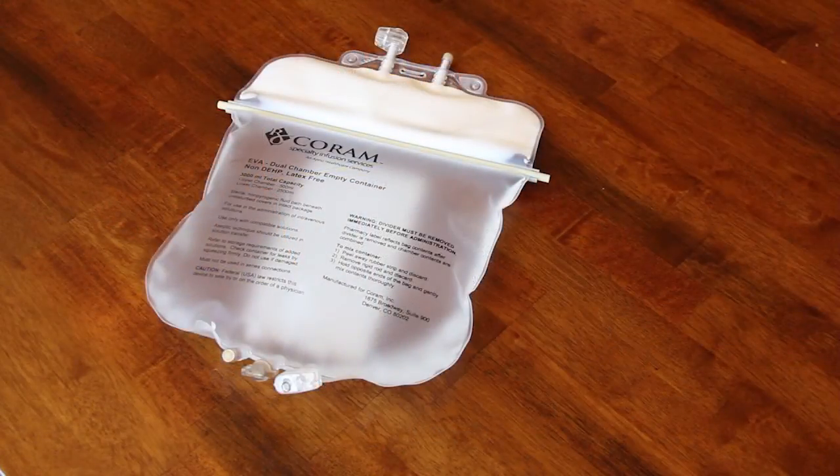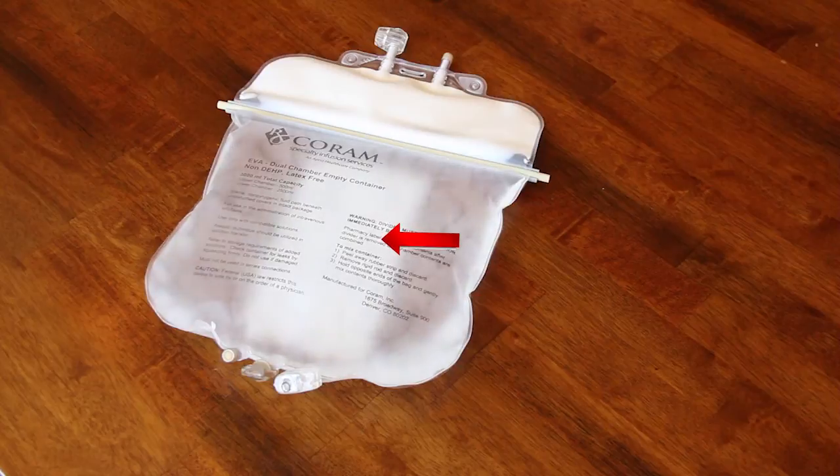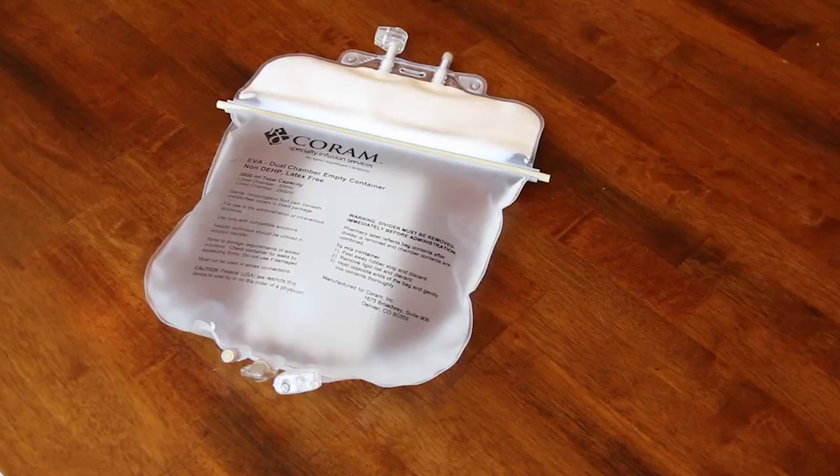As you unpack your TPN, look at them closely to make sure the rod and strip are securely in place. Also, make sure that the fat looks like milk without any streaks or discoloration. The solution in the lower chamber should be clear. If the clear solution in the bottom chamber looks murky or milky, that means the divider may have been dislodged during shipping.